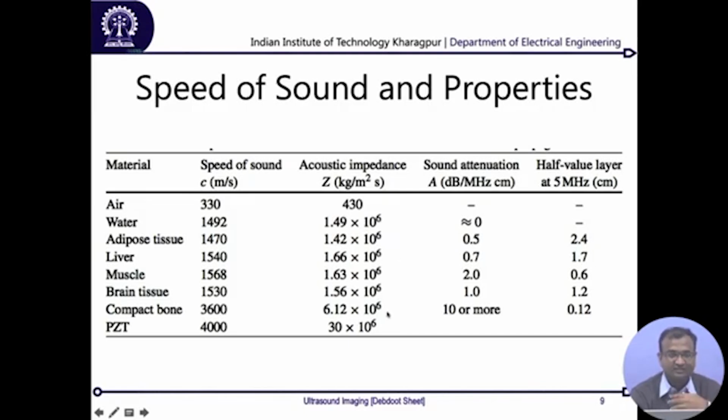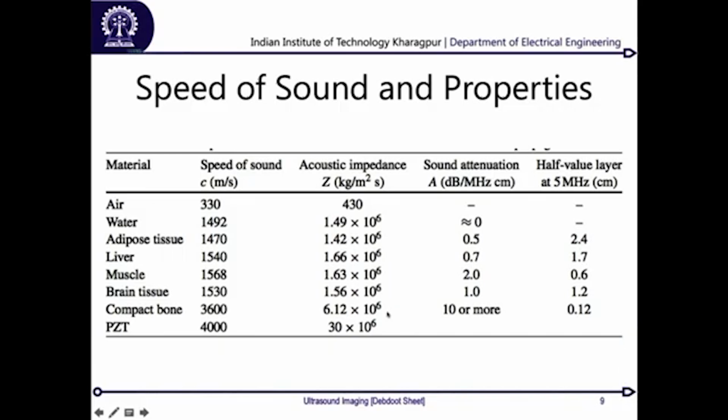So this is the reason why your depth of ultrasonic imaging is very much limited. You cannot just go for an infinite depth of ultrasound imaging over there, you have a very finite depth, because after some time you are just going to lose all viable amplitude and will just be getting a lot of noise coming to you.